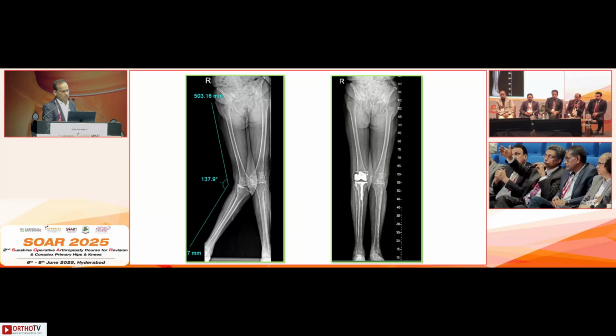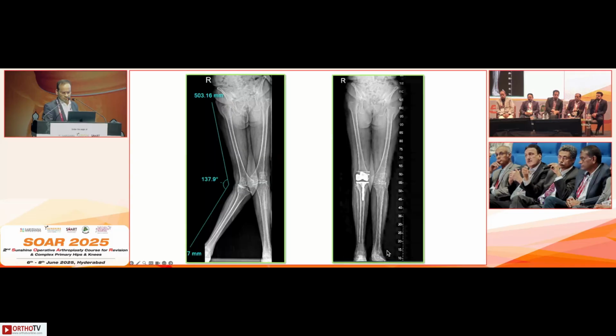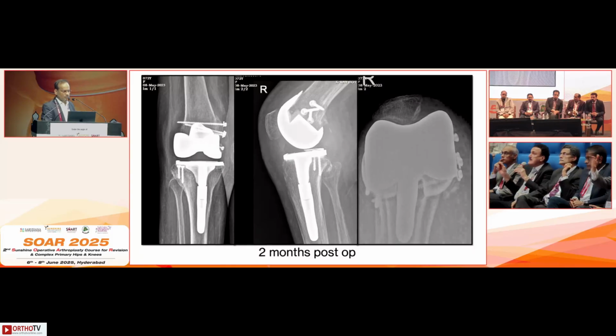Second thing, even the bone is so osteoporotic. You make an osteotomy, shift it proximal, put 2 screws, it just crumbles. I do not know whether it will really remain long and be stable in that situation. So this is around 2 months, 2.5 months post-op.